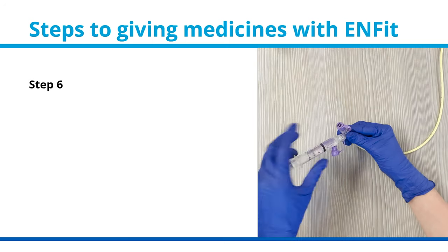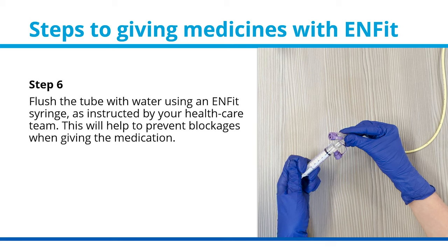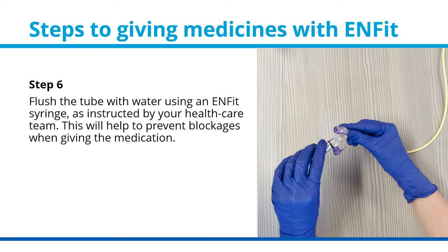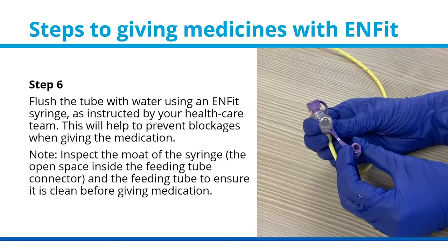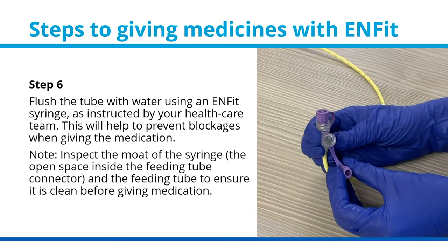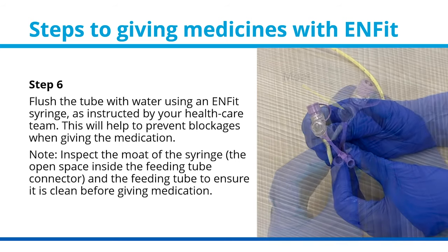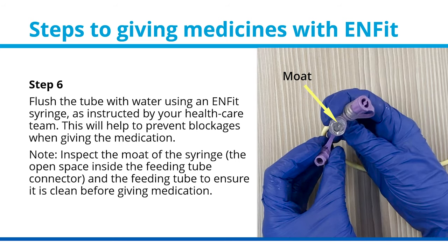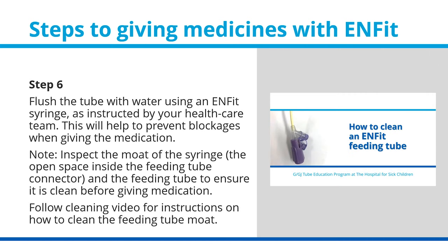Step 6: Flush the tube with water using an ENFIT syringe, as instructed by your health care team. This will help to prevent blockages when giving the medication. Note: inspect the mote of the syringe, the open space inside the feeding tube connector, and the feeding tube to ensure it is clean before giving medication. Follow the cleaning video for instructions on how to clean the feeding tube mote.